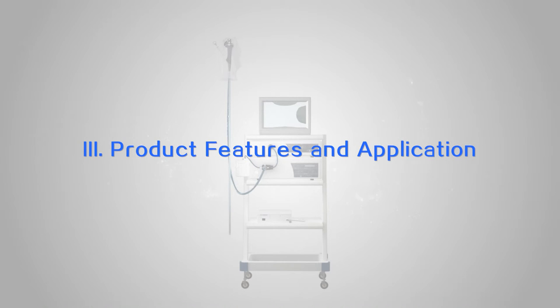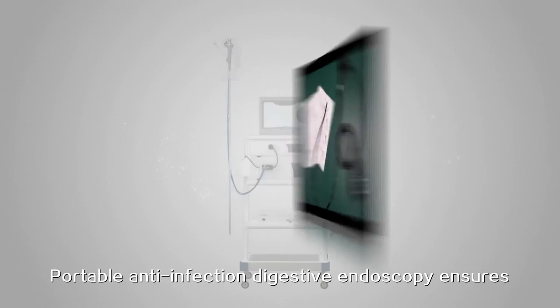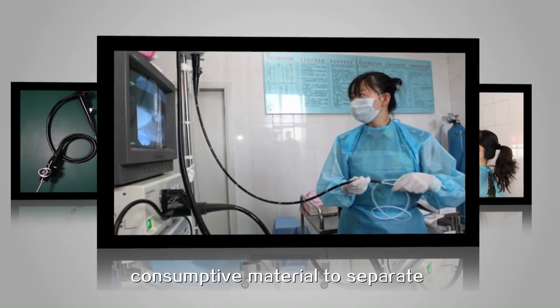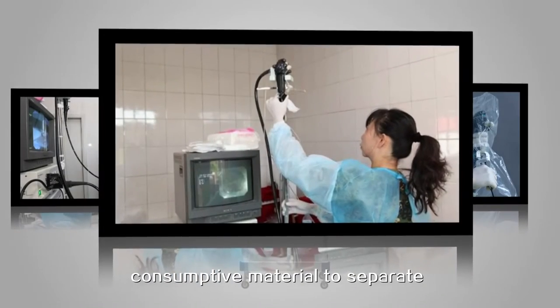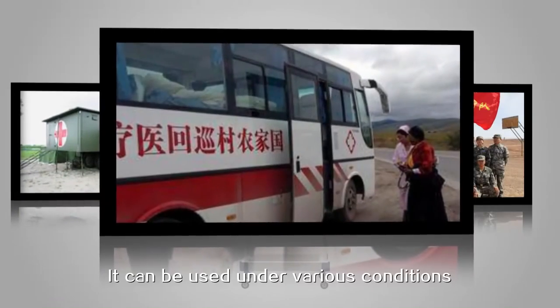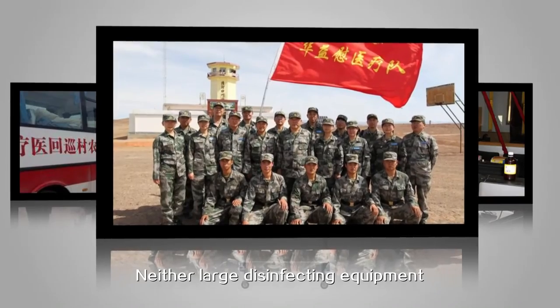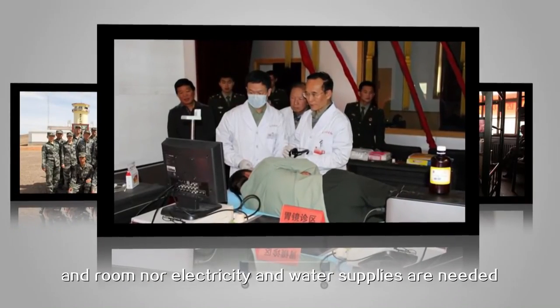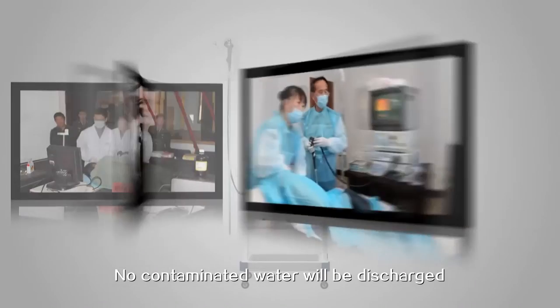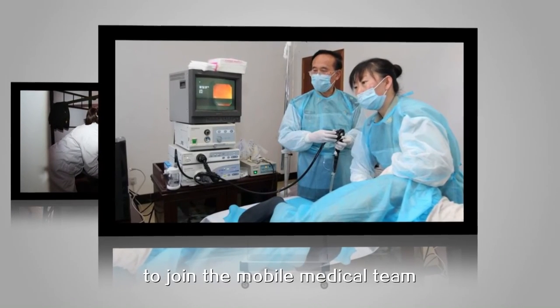Product features and application: the portable anti-infection digestive endoscopy ensures the reliability of the endoscopy by covering it with consumptive material to separate the patient and the endoscopy. The consumptive material is small and easy to carry, which improves the portability of the endoscopy. It can be used under various conditions — neither large disinfecting equipment and room, nor electricity and water supplies are needed. No contaminated water will be discharged, which helps the gastroenterologist to join the mobile medical team.